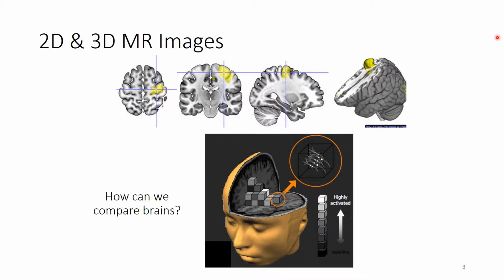You can look at the brain in many different ways. We'll mostly be looking at 2D representations of each of the three views we've discussed as we move throughout the course. You can also use 3D images, which can even separate anatomical points of interest. The image on the bottom shows loosely what is being analyzed in fMRI. You have clusters of nerves, and as blood moves in, the signal they emit changes. When we look at fMRI results, they are mapped onto structural MRI scans, so we can see where these blood flow changes are taking place.